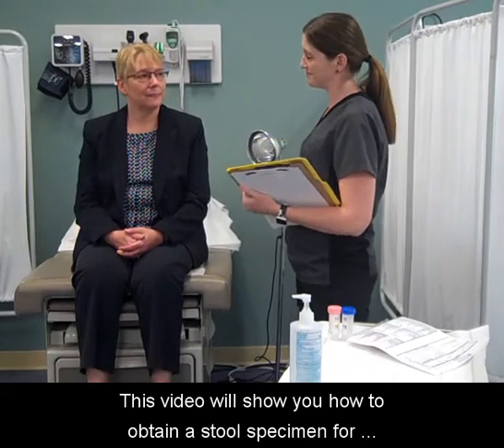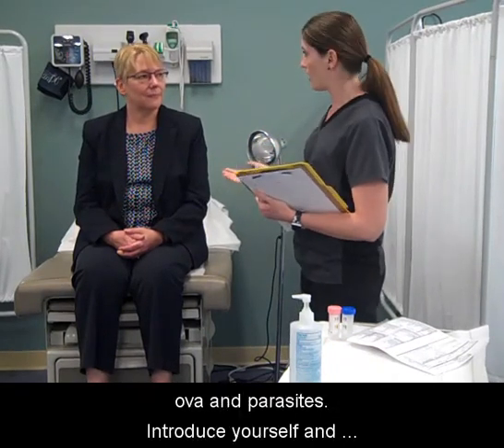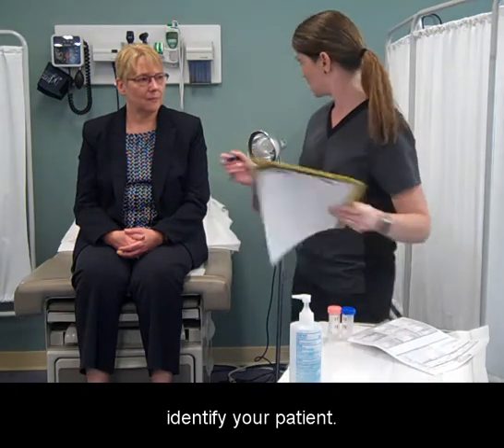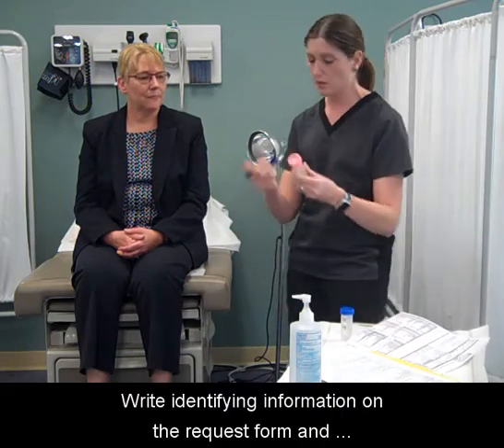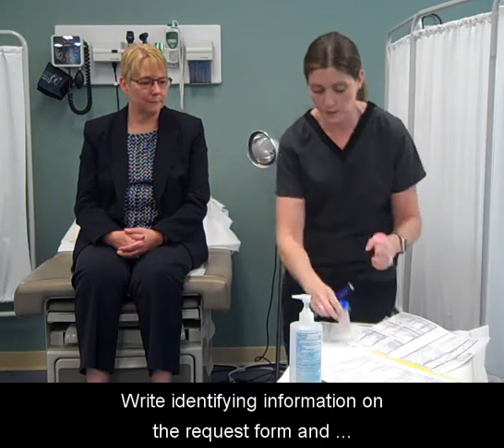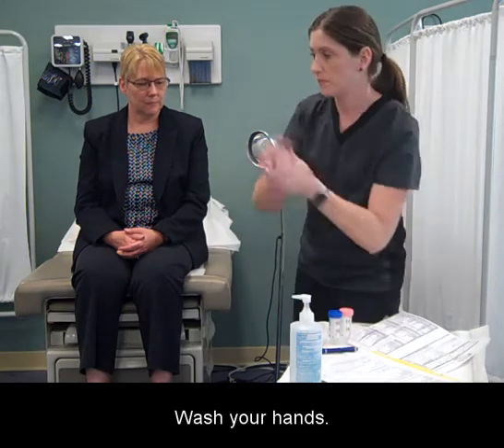This video will show you how to obtain a stool specimen for ova and parasites. Introduce yourself and identify your patient. Write identifying information on the request form and specimen container labels. Wash your hands.